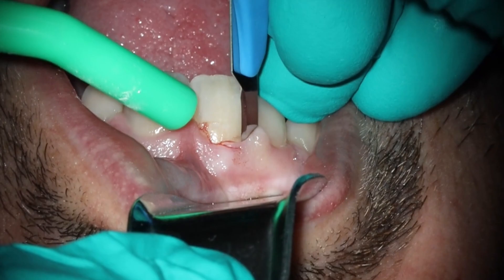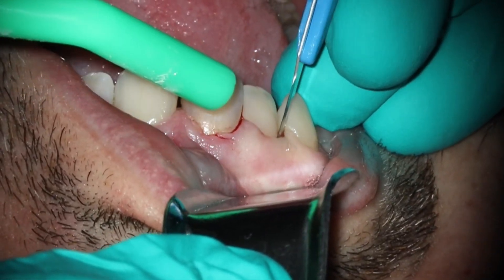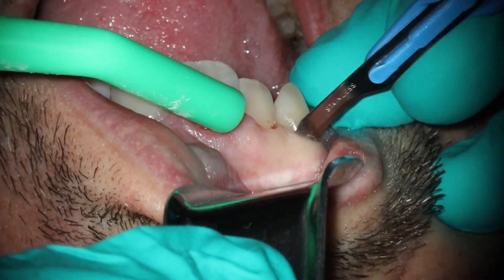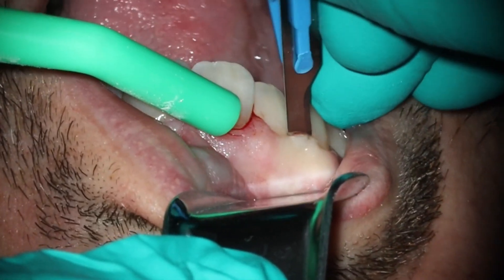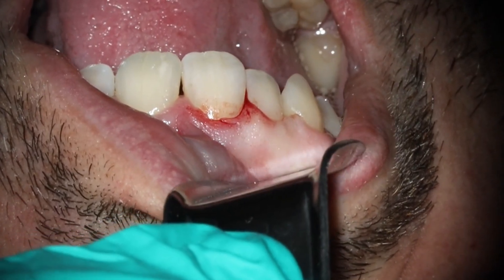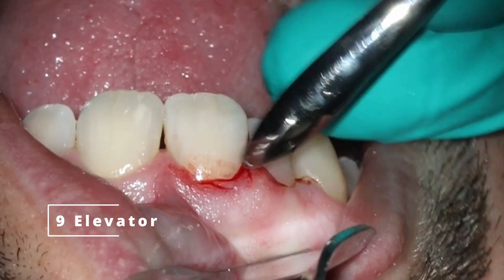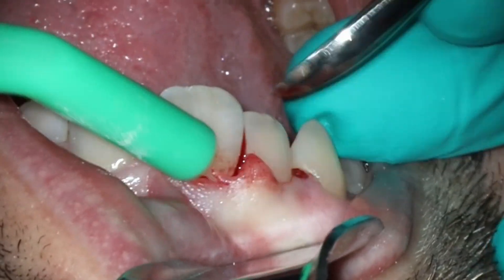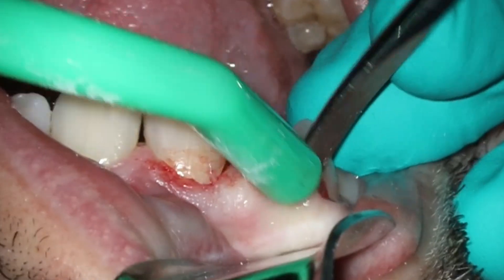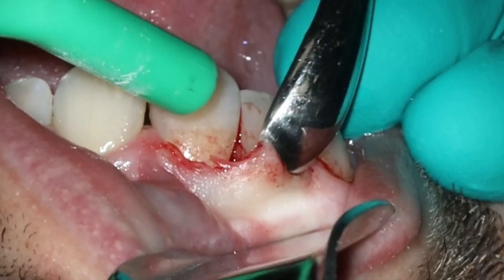You can see what we're doing now is going to go and start laying the flap. I had finished the root canal before this. You can see the gingiva was a little bit — that little slice there was actually from the rubber dam, the number nine being on top of there. So what I'm doing here is taking a 15 blade, trying to keep this as conservative as possible. I'm going to do an envelope flap, no verticals on this one whatsoever.